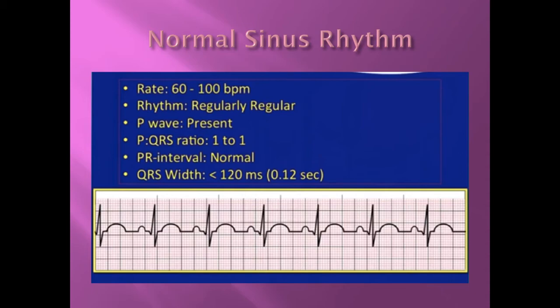These are both things that you need to mark on your printout because they will be worth points. All you need to do is say the PR interval and the QRS width needs to be within what ranges, and you'll get points for that, all right? Just label that somewhere on your sheets, very important.